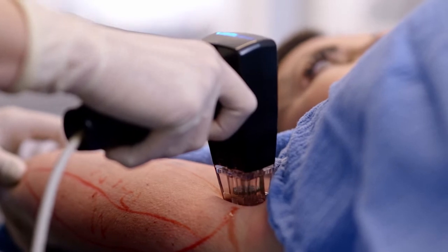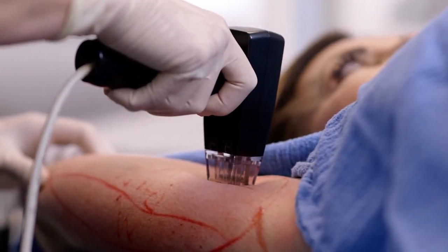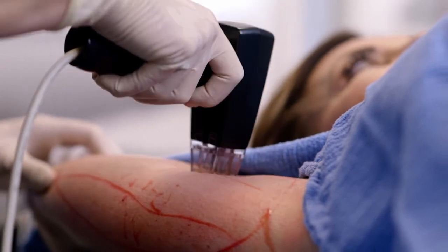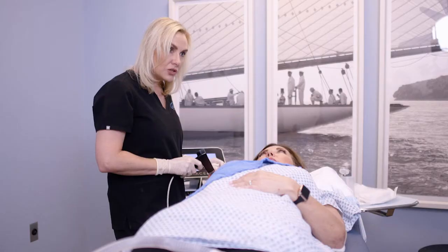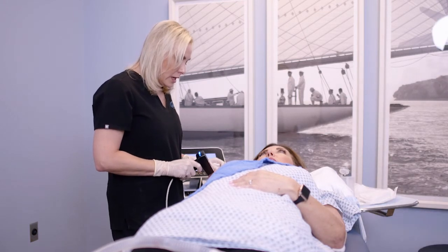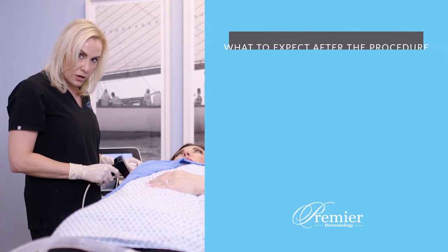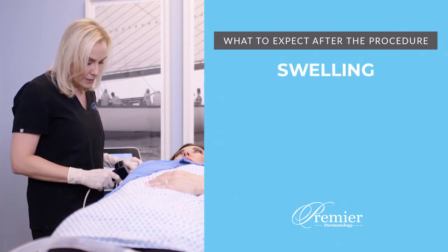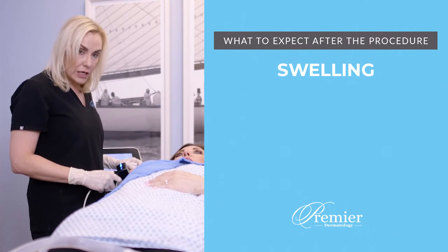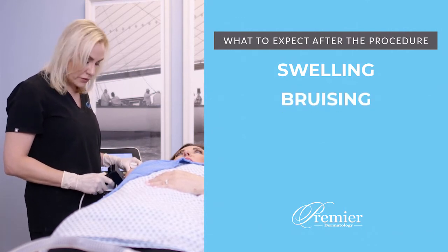So after this procedure, she will be very swollen in this area. We actually filled this area with a lot of very dilute lidocaine solution called tumescent anesthetic. And it makes it very comfortable for the procedure, but it actually does cause some swelling just from the infiltration of that. The actual treatment itself, you can see some bruising, can definitely see some swelling just from the treatment itself.